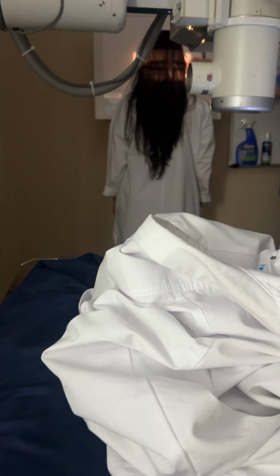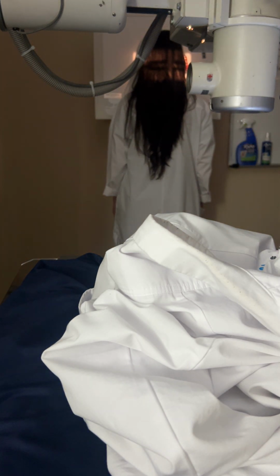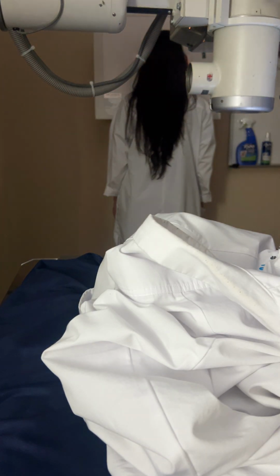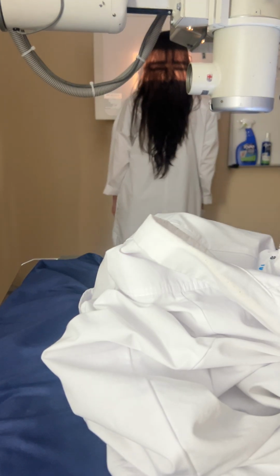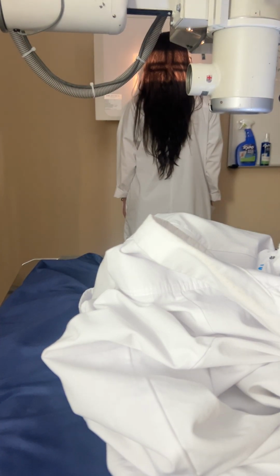So basically, you just want to come to the side of your patient and make sure that your collimation includes at least up to the EAM. That will include the condyle of the mandible, and you want to make sure that your collimation includes under the chin. If you've got both of those things in your collimation, and your patient is nice and centered, and that OML is parallel to the floor, you're good. This is the OML, right? Here to here. OML, IOML. 7-degree difference. Okay?